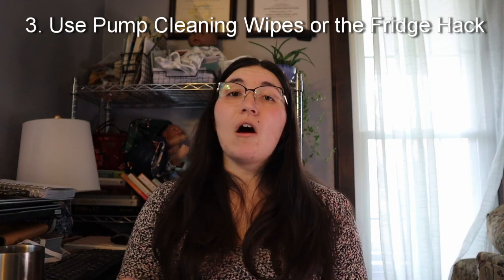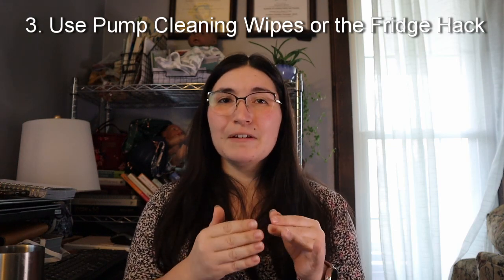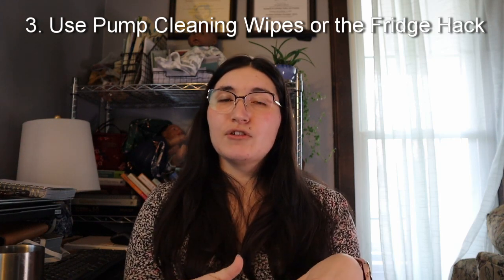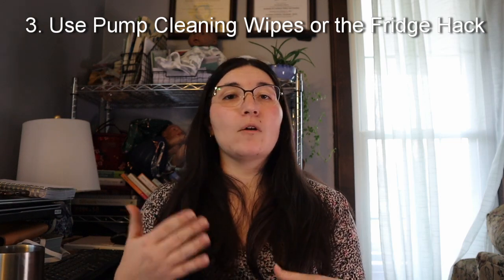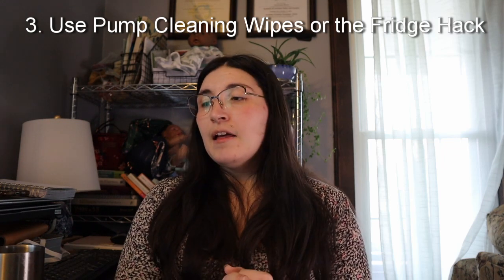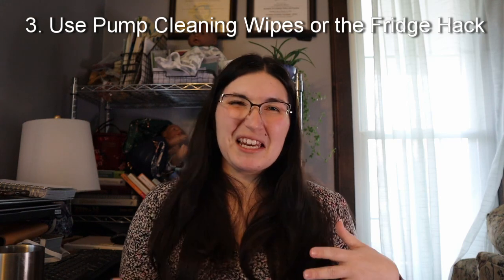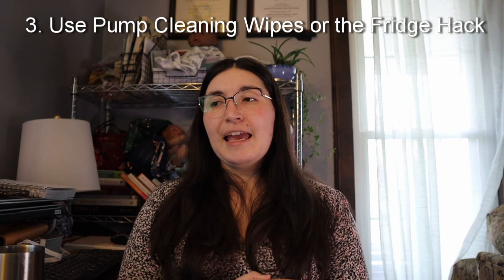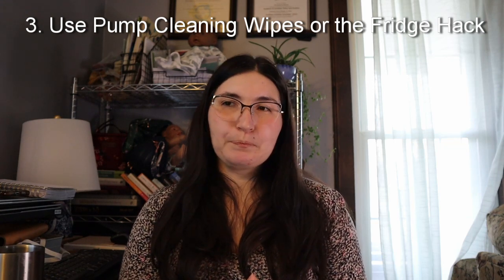You want to make sure that you get all of the pieces, every single bit that touches the milk, clean and wiped off, and try to make sure that they're dry enough when you put them back in your pump bag or in your wet bag, or a zipper plastic bag. That way, it minimizes the chances of them getting funky and gross in between pump sessions, and you don't have to worry about all your stuff getting all milky.